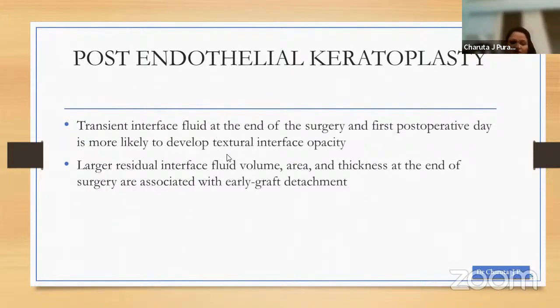So interestingly, these are the routine applications which we have very commonly seen. However, there are now studies which have predicted that post-endothelial keratoplasty, it is imperative to do OCT assessment in the immediate post-op, between 1 hour and 1 day post-operatively. It is invaluable because of the transient interface fluid at the end of surgery and in the first post-operative day. They have shown that such fluid is more likely to develop textural interface opacity, which we very commonly see, and leads to loss of best corrected visual acuity.